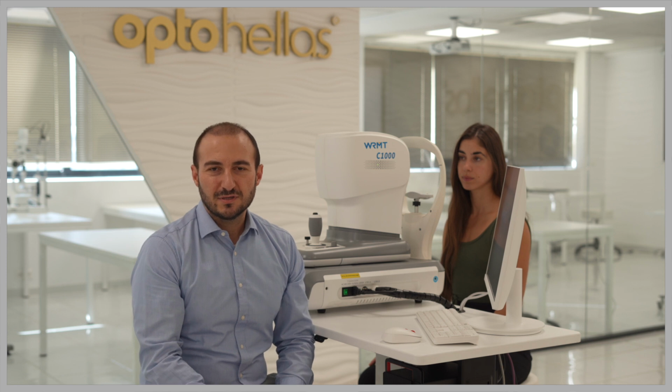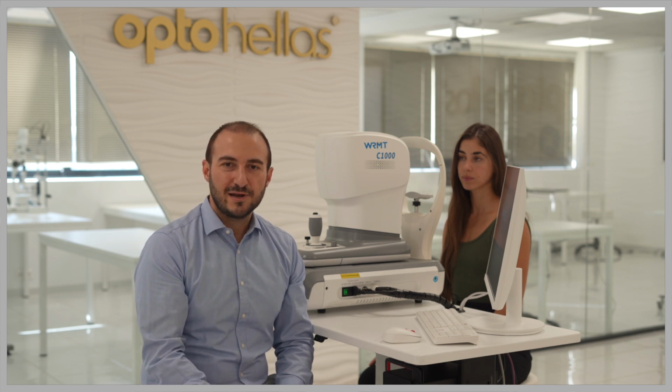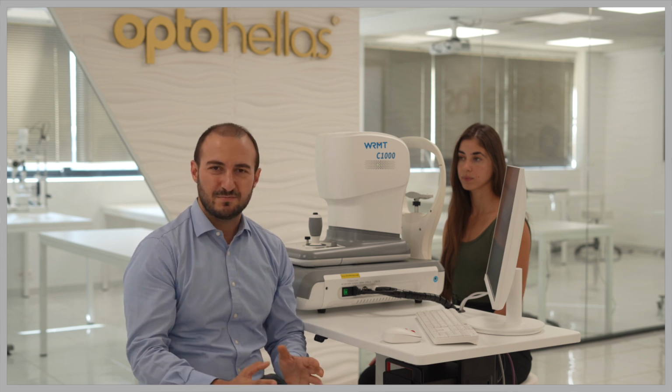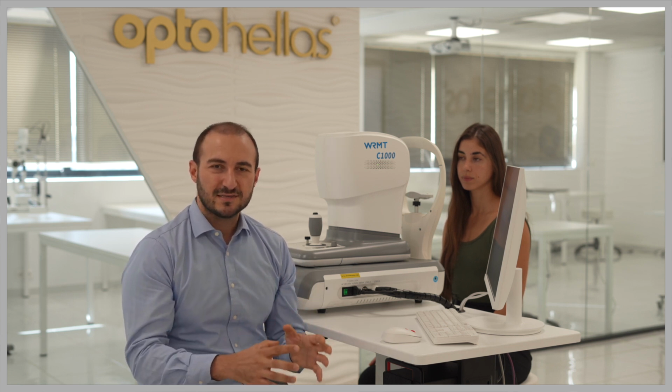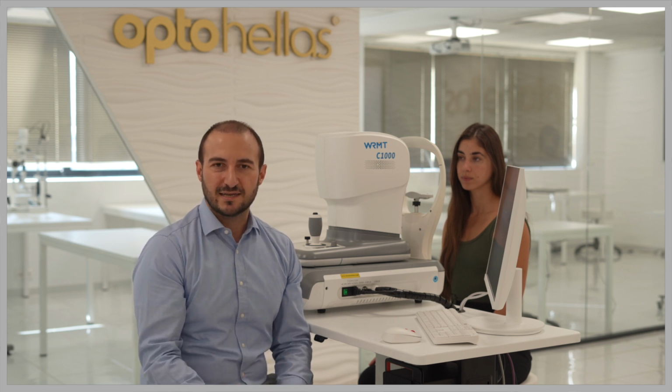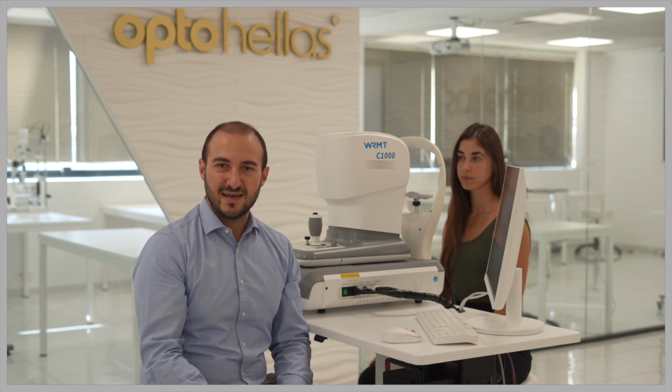Velite C1000 is our new SLO ultra-wide OCT, and in this user guide I will show you step by step how to operate the device, how to use the software, and all the official features and characteristics of the device.